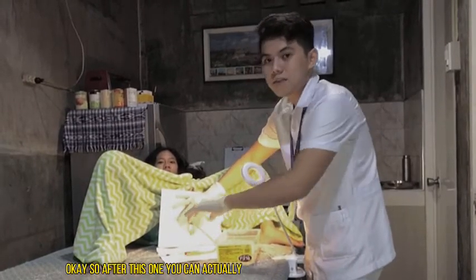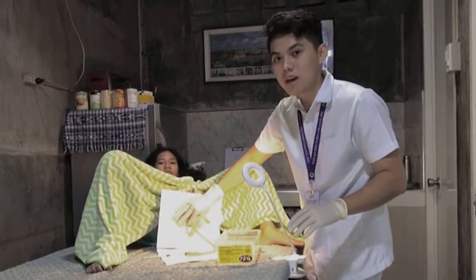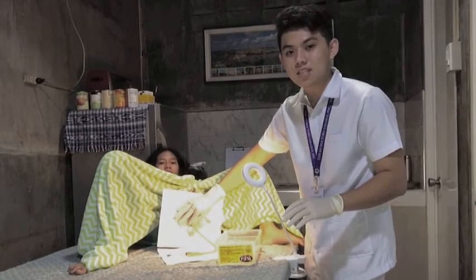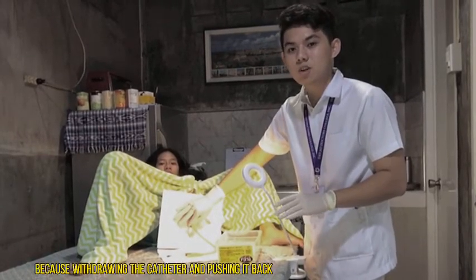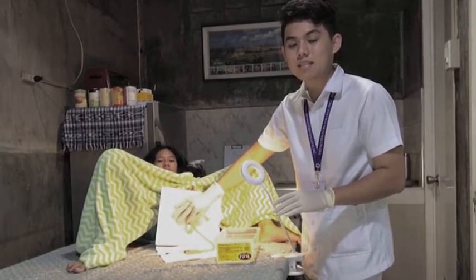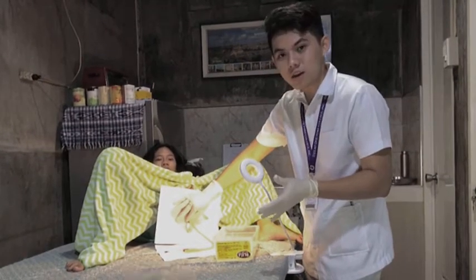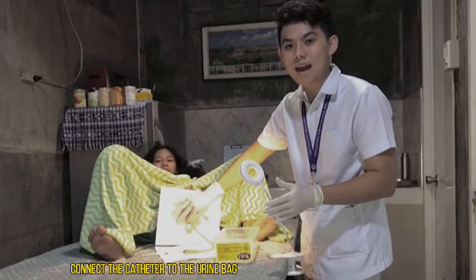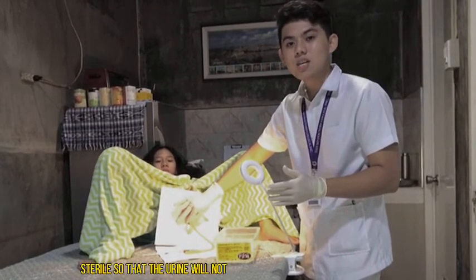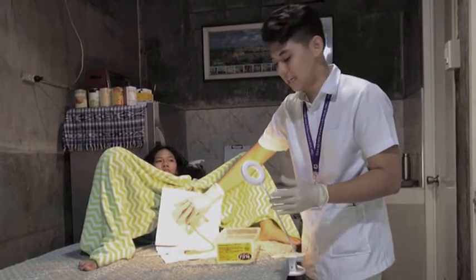Okay, so after this one, you can actually rest your hand in the pubis area, just like what I'm doing right now, while holding the catheter in place to prevent pulling and pushing of the catheter. This is important because withdrawing the catheter and pushing it back in the urethra increases the possibility of urethral contamination. So after this one, connect the catheter to the urine bag and be sure that the bag is closed and keep the connection sterile so that the urine will not leak from the bag, maintaining its sterility.